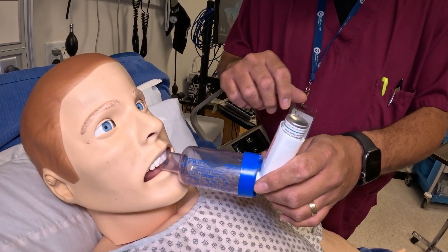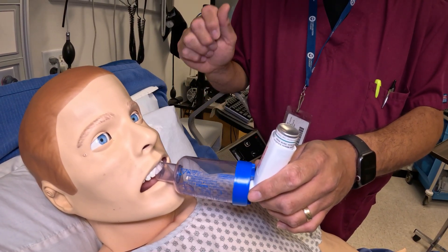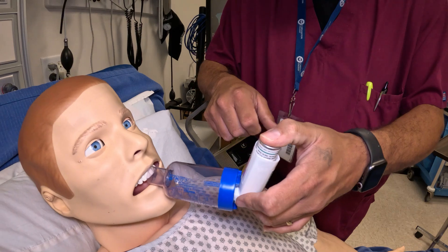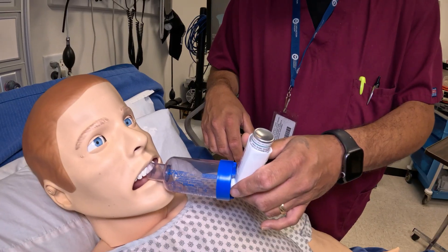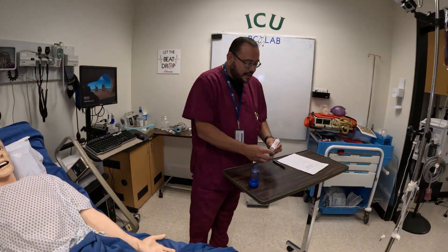He's holding it, and then now blow out. Depending on the type of spacer, you may see a flap move — you may not — but he's taking the medication in. He's going to hold it for a little bit and then breathe out. Then Mr. Smith, I'm going to have you do it again — I'm going to push down the medication. He's going to take a big breath in, hold, and then breathe out. Then we're done. We're going to take this out and put the cap back on.